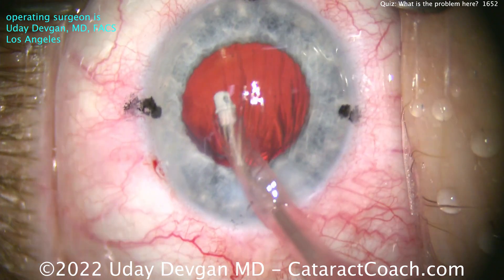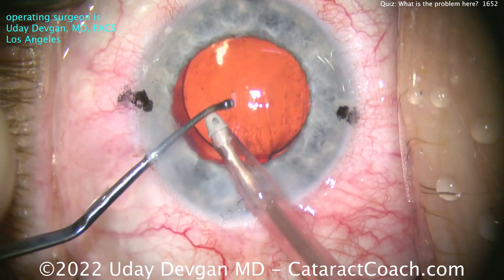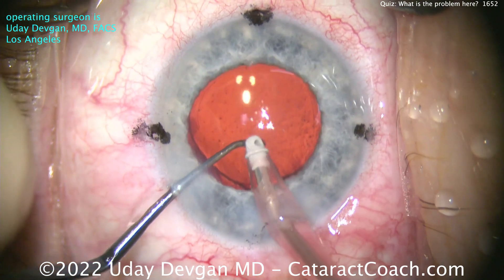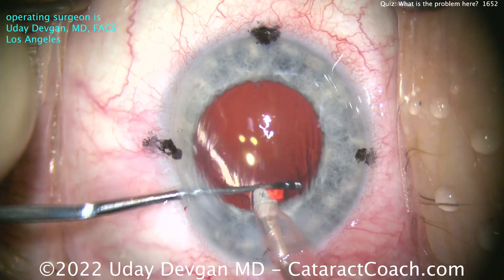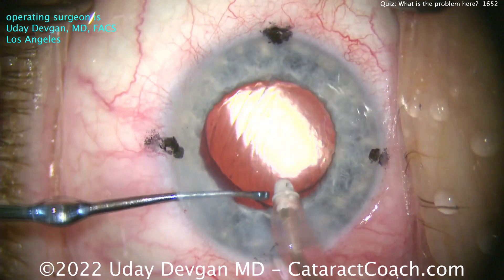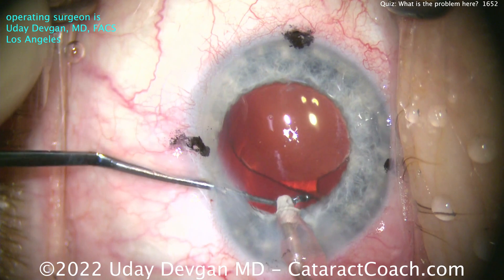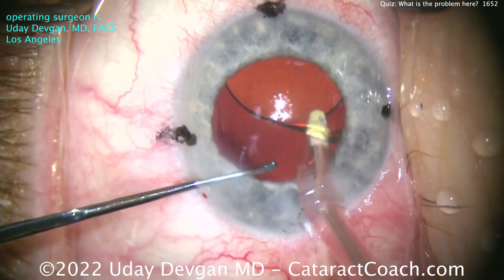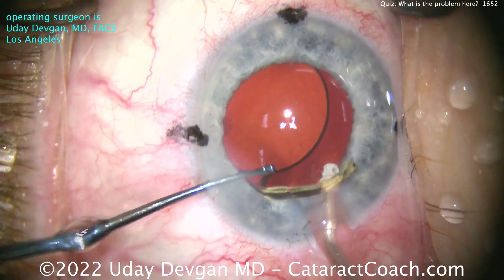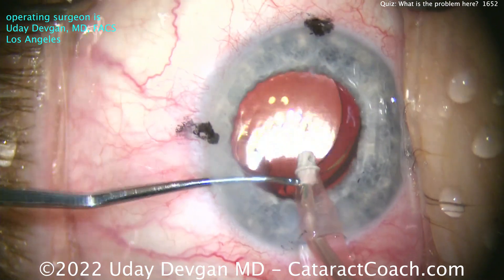No, I know better than that. I'm going to inflate the eye here with the foot pedal and go in with the chopper, because as that last haptic that was stuck to the optic opened up, it opened up into the sulcus — it's not in the bag. That trailing haptic is sub-incisional right now. You may think it's fine, but it's not — it's not in the bag. I'm trying to get it lifted up. There's that haptic — that's the issue. I don't want to misrotate the lens because it's already in a good position.